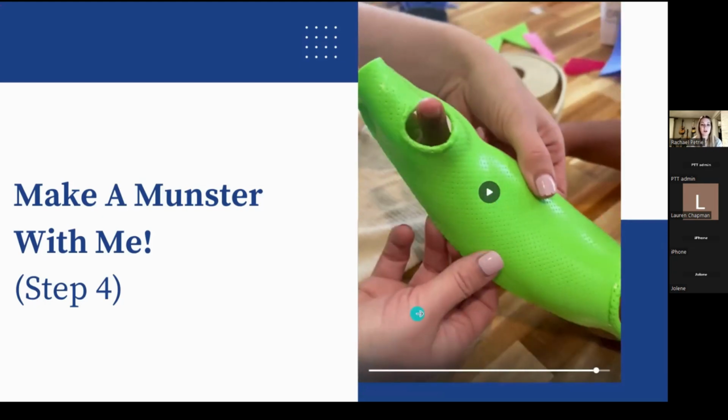Okay, and then when you take the splint off, you always want to flare it and then pull it back off. Same with putting it on. You'll flare it, you'll open the splint up, and then you'll put it back on. That way you're not shearing and having any friction against your skin.